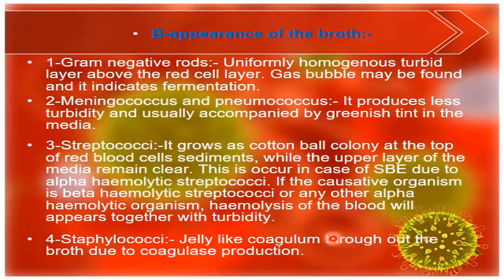Okay. Appearance of the broth. How can I suspect the type of microorganism according to the appearance of the broth in the blood culture? If we see a uniformly homogeneous turbid layer above the red blood cell layer, gas bubbles may be found.